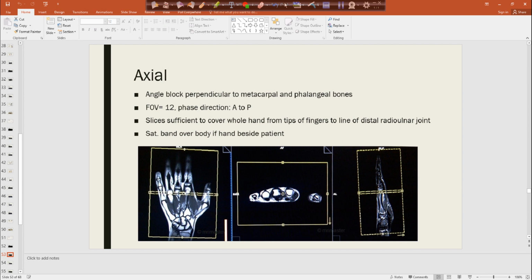Make sure you flip through all your slices on these because you think you're through all the fingers, but then your middle finger keeps going. You don't want to cut off any anatomy. So flip through all your slices to make sure you have all of your anatomy covered within your field of view. A lot of people sometimes say they want to see one slice that's purely air, right? To prove that you've covered all of the anatomy.